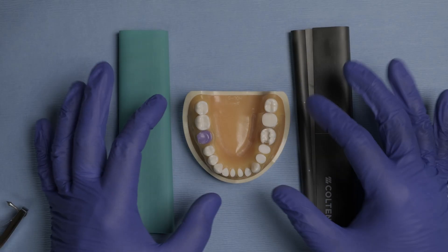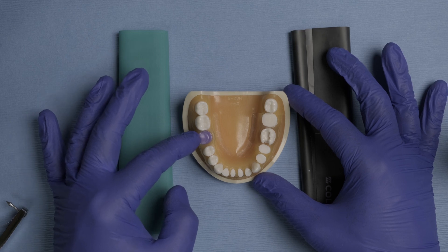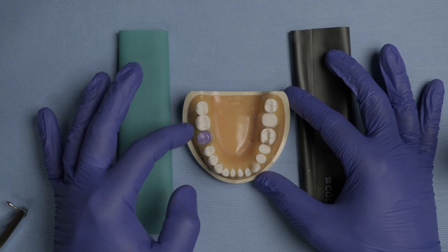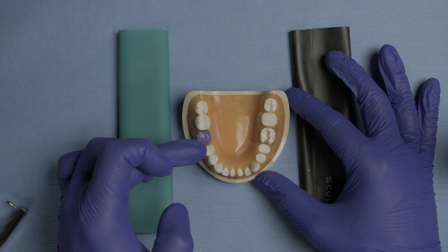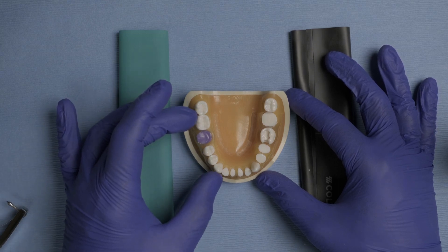In this example, we're going to use this denteform where tooth number 30 has been extracted. We're going to place a clamp around tooth number 31, allow the rubber dam to seal the area between 31 and 29, and then include in our isolation teeth 29, 28, and 27. That is the goal we want to accomplish.